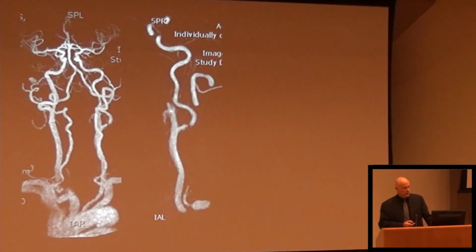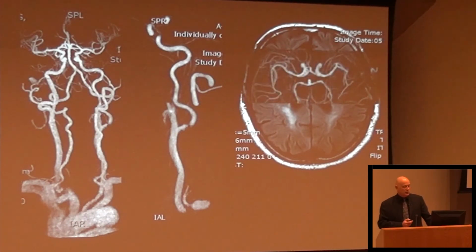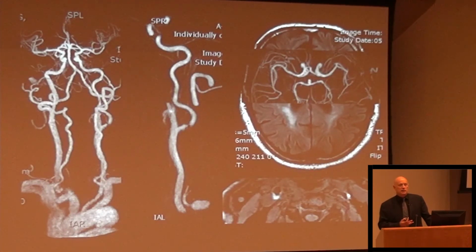Similarly, this patient, with again a very similar picture to one that Ben showed, just with a small bite taken out of that proximal carotid artery. They're having problems in their head bilaterally. They have high signal intensity in their deep white matter, suggesting ischemic disease. Their actual circle of Willis doesn't look too bad, so it's probably disease coming more proximally. And when we look at their carotid arteries, we can see high signal intensity within both of their internal carotid arteries, marking out that they have active disease going on within their carotid plaque bilaterally, whereas the stenosis would only suggest that it's on the one side.